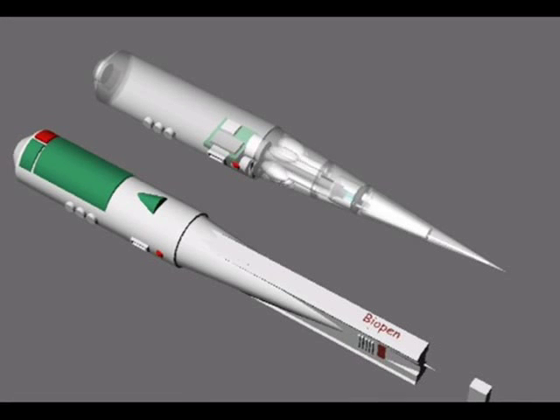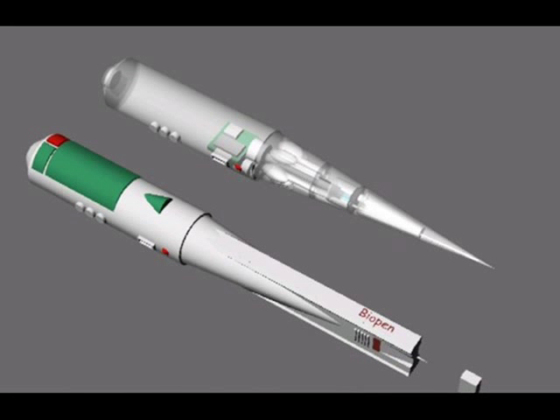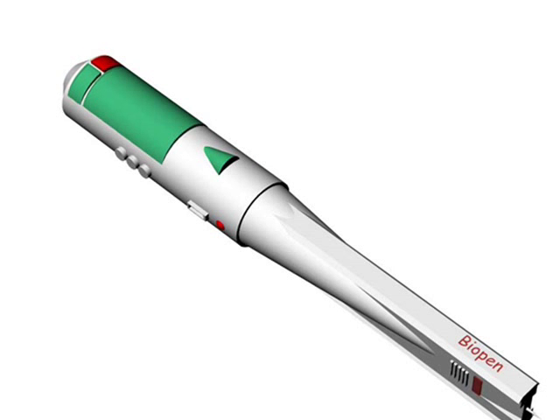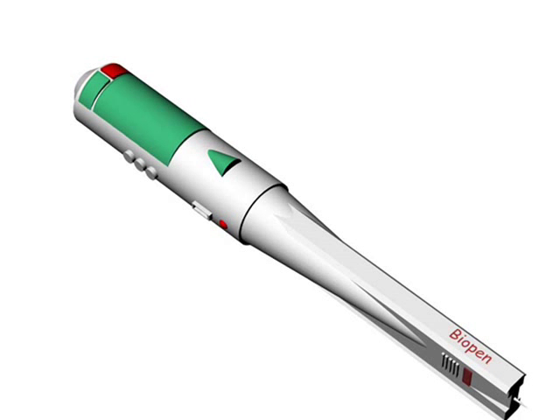Doctors may soon be able to draw bone, skin, and muscle onto patients after scientists created a pen-like device — the BioPen — that can apply human cells directly onto seriously injured people using 3D printing methods.